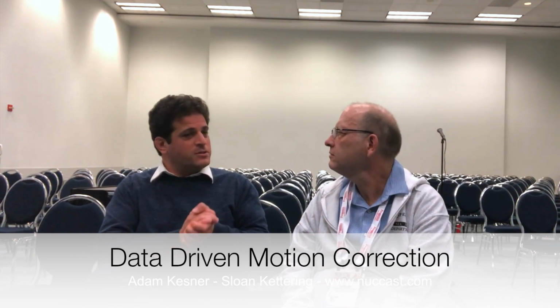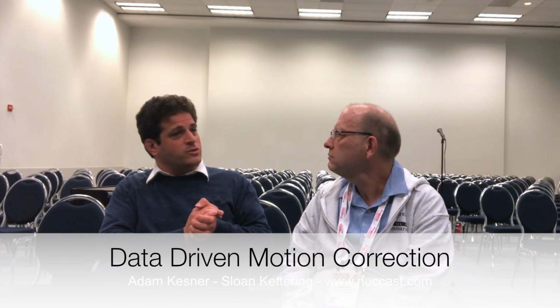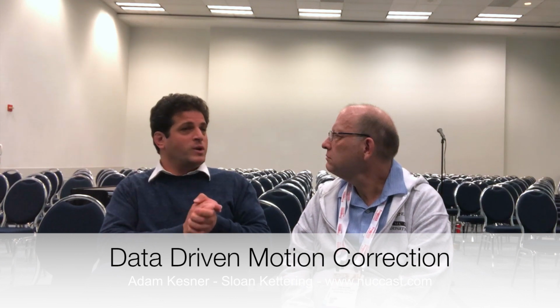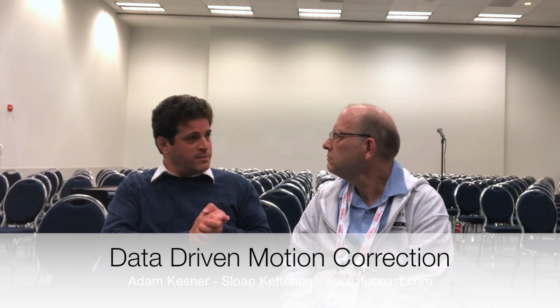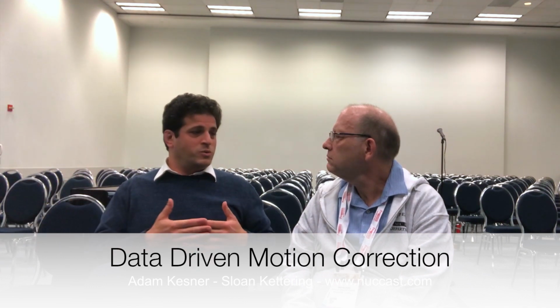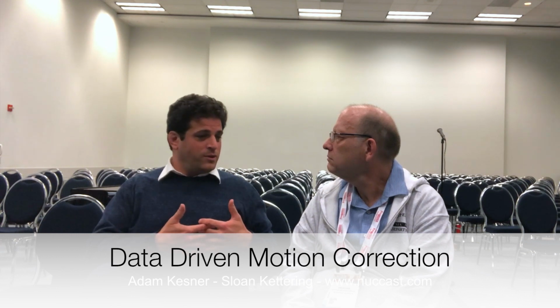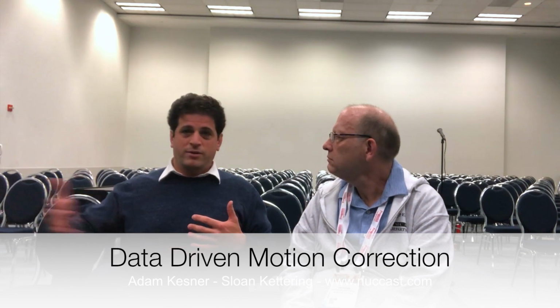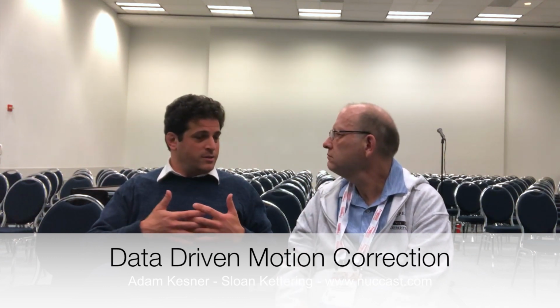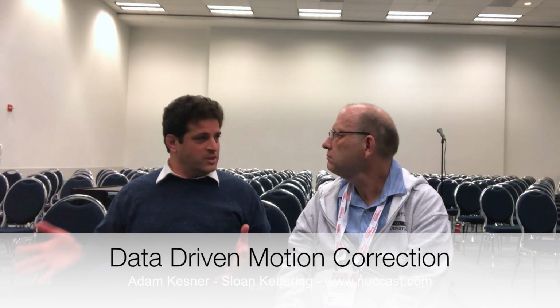But it's half a solution that, right now, data-driven motion correction can replace the only hardware-dependent process in the image motion correction chain. So once we're able to remove hardware entirely, we could play with fully automated solutions that are operator independent, that are run in the background, and can be run on 10, 100, 1,000, 10,000 scans.